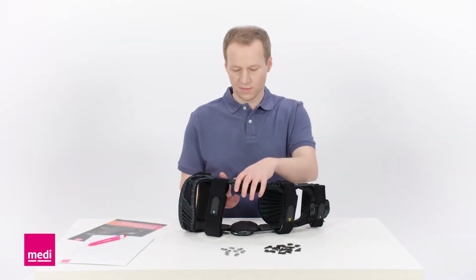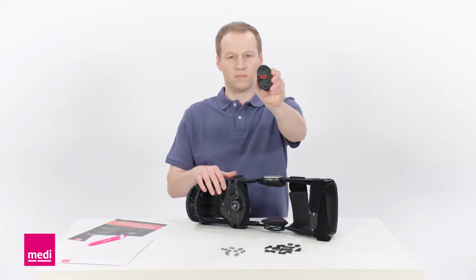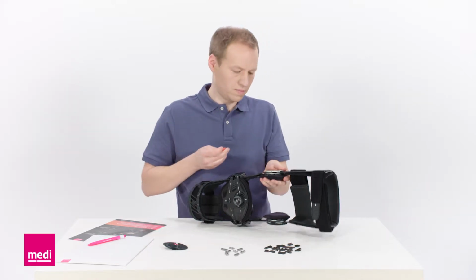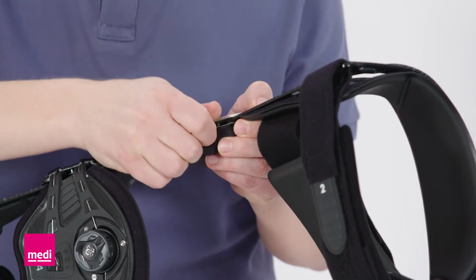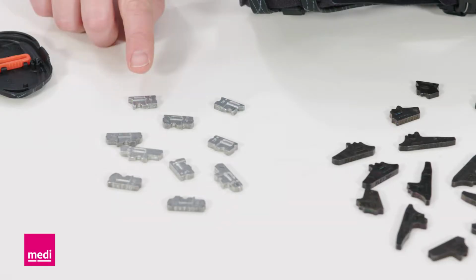To replace the wedges, press the hinge cover out and away. Remove the tweezers from the hinge covering and, with them, pull the wedge out of the hinge. To ensure correct positioning, all wedges are labeled with the respective function and the corresponding degree setting.